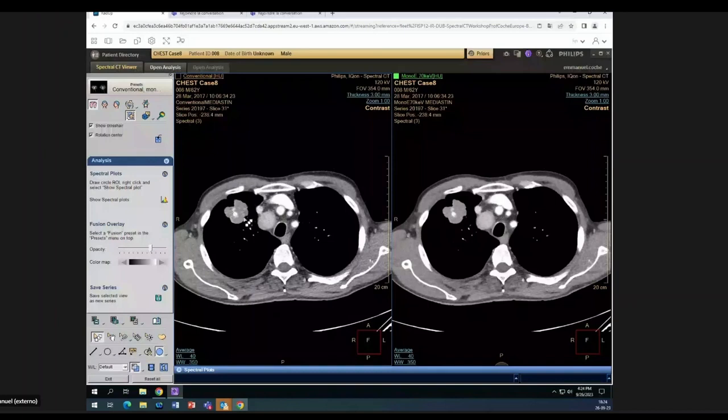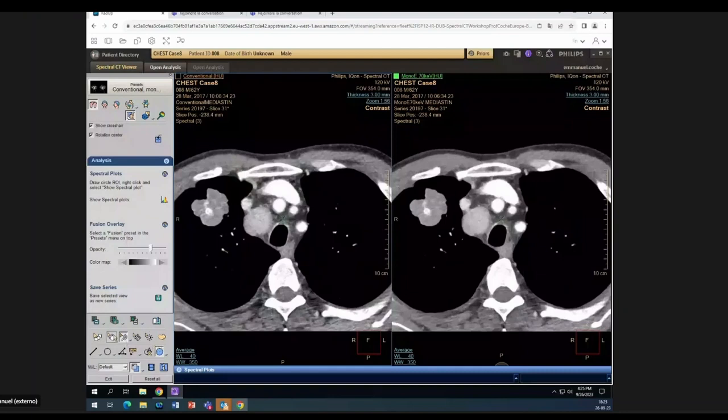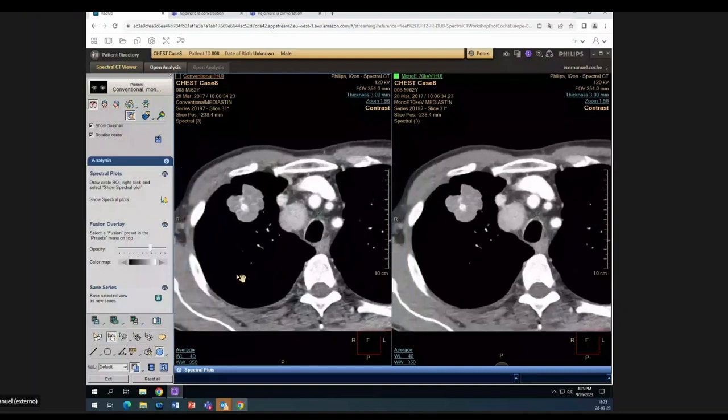It's a lobulated mass. If you zoom it, we can zoom. I hope you are familiar with that. You can pan, you take this button, you pan. You take the density, you will select a circle. You take your region of interest inside this hyperdensity. You see that the value is 218. Is it calcium? Is it iodine?